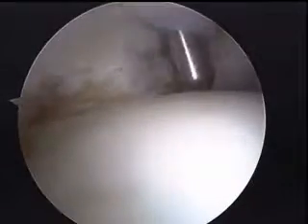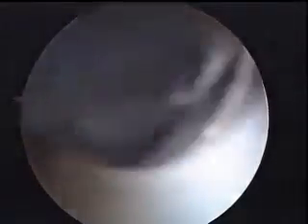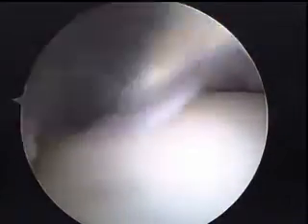We see the damage more on the acetabular side than the femoral head. But again, you can see that I go very straight over the area, not curved anymore. So as soon as we get this cleaned up a little bit, get our view a little bit better, ensure that we have complete access to most of the femoral neck with motion, we will do our osteoplasty to prevent any continued damage in the hip.